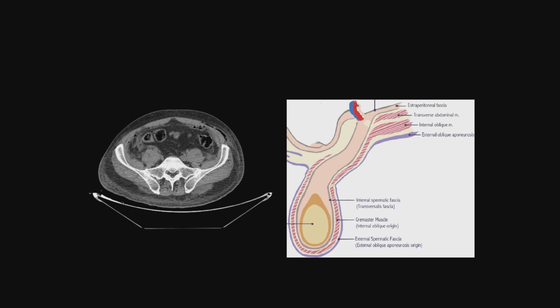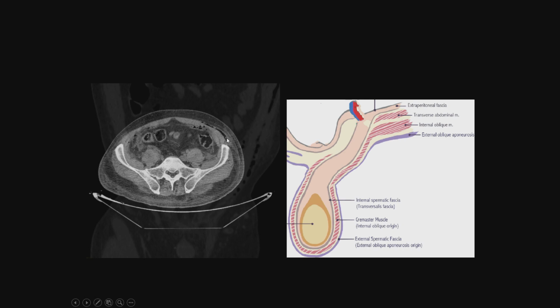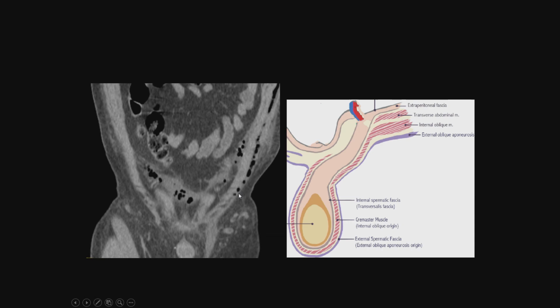And this is important because through the contralateral part, it infected the abdominal wall, and it came to our attention that through the left abdominal wall, the internal oblique muscle, here it's our same patient, the internal oblique muscle seemed to be affected, and we saw some edema and some fat stranding extending to its anatomical sibling. What's the anatomical sibling of the internal oblique muscle? The cremaster, right? So this is a depiction of how this anatomical detail helps to see how the infection was sent to the cremasteric muscle.